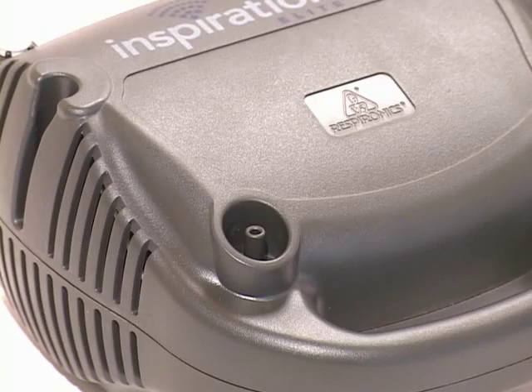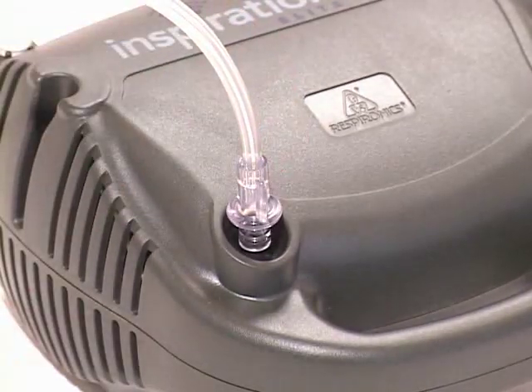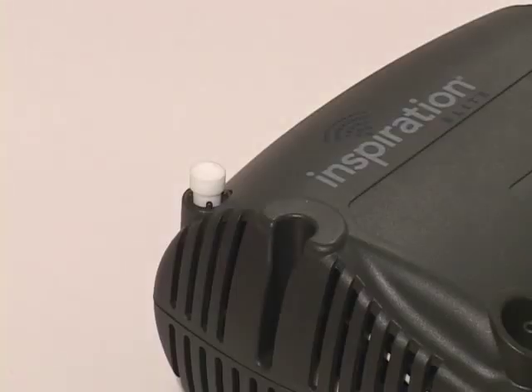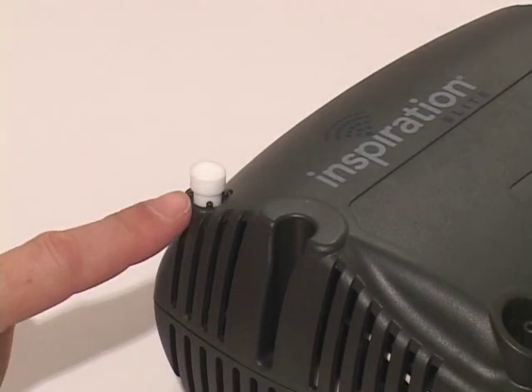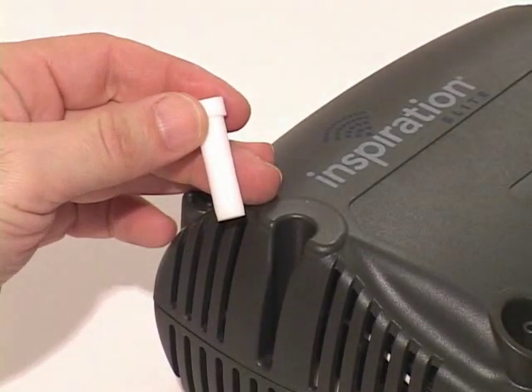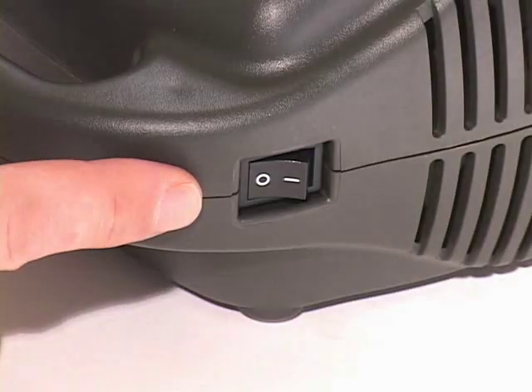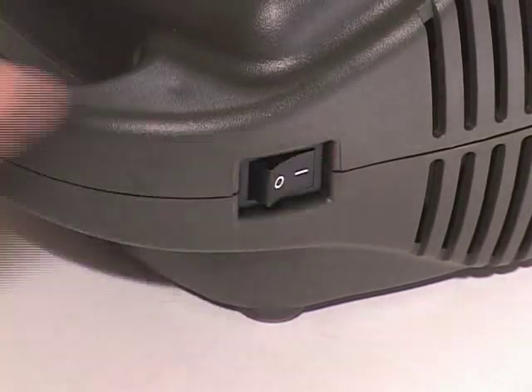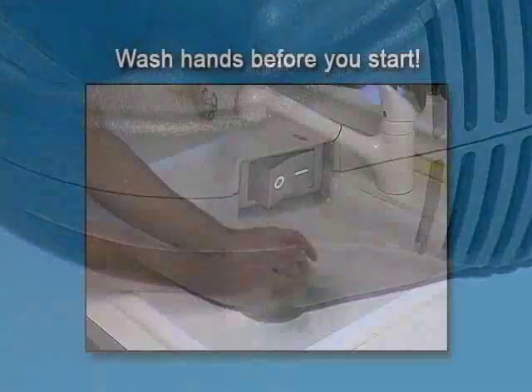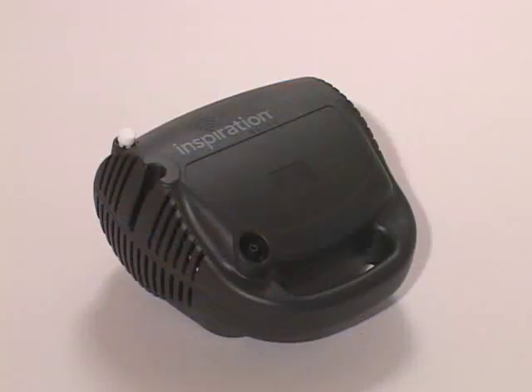The tubing that comes with your nebulizer handset must be connected to both the compressor and the nebulizer handset. You should regularly check the air filter. Pull the filter from the top of the compressor and replace it if it becomes dirty. Turn the compressor on and off using the power switch on the right side. Remember to always wash your hands before you set up the nebulizer handset. You're now ready to begin your treatment.